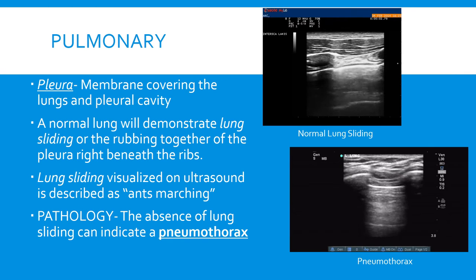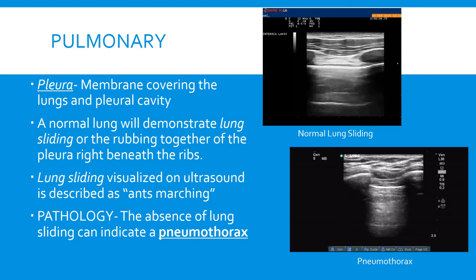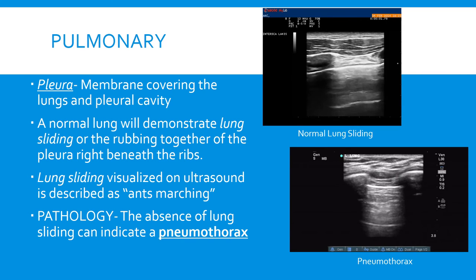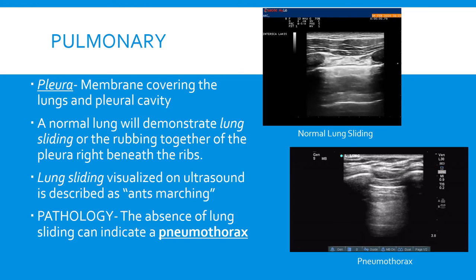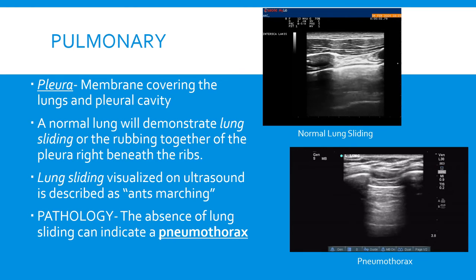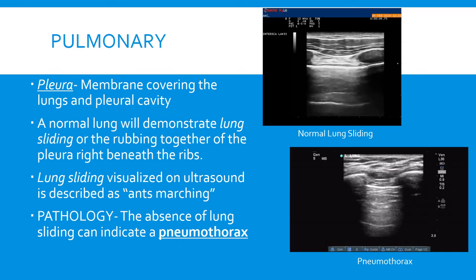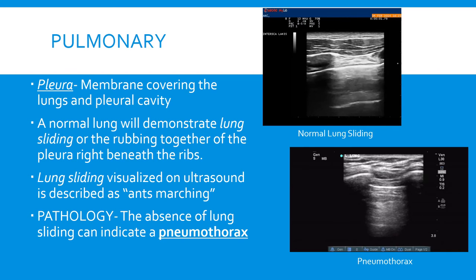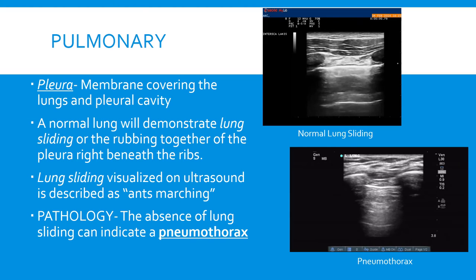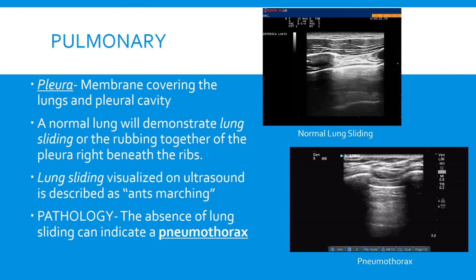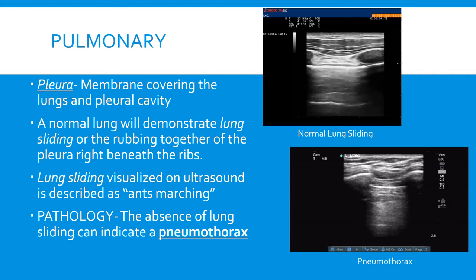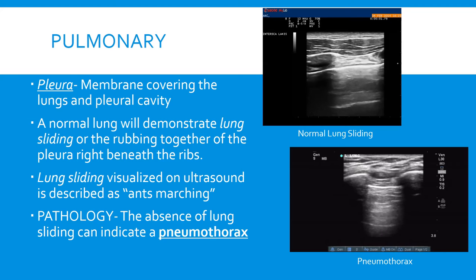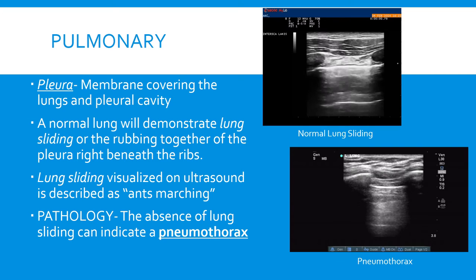Next I want to talk about the pleura and the pleural line. If you look at the picture on the top, you'll see the ribs on either side of the screen with rib shadows behind them, and just inferior to that you'll see a white line — that's the pleural line. It's made up of the parietal and visceral pleura rubbing together, seen as a white stroke moving back and forth. A lot of people describe that as ants marching or ants on a log. This is a normal finding.